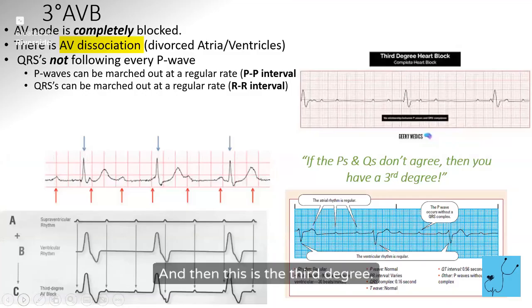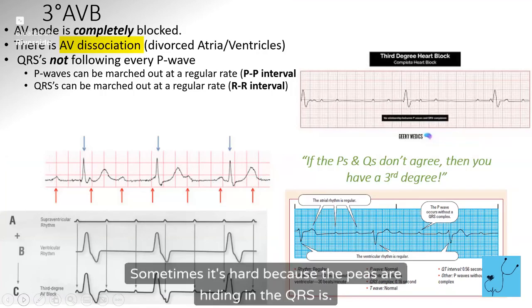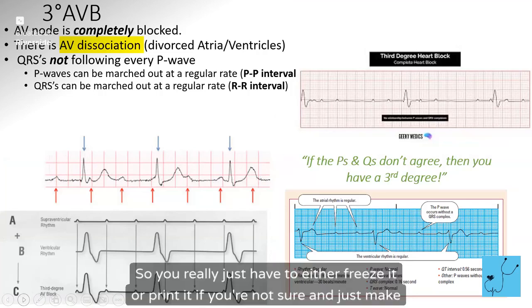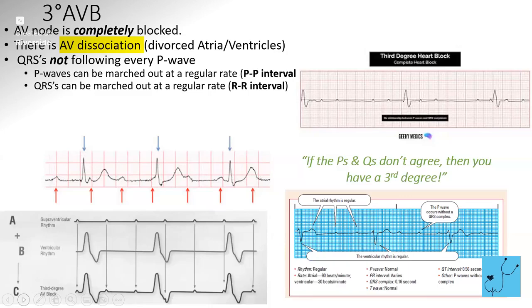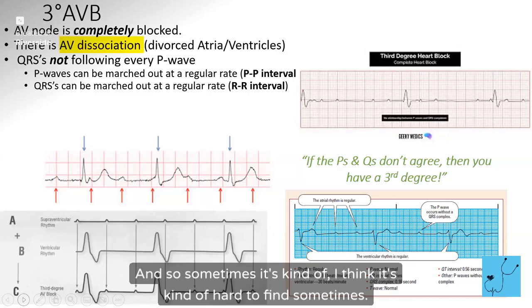And then this is the third degree. Sometimes it's hard because the P's are hiding in the QRSs. So you really just have to either freeze it or print it if you're not sure, and just see what marches out. Because like this looks like idioventricular. That's kind of what it looks like, just a wide, slow QRS. And then here, you have some P's, but like there's a P in there. Sometimes you can't even see the P inside the QRS, and I think it's kind of hard to find sometimes.